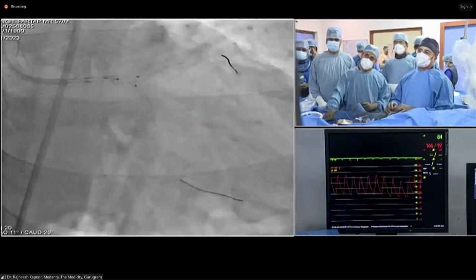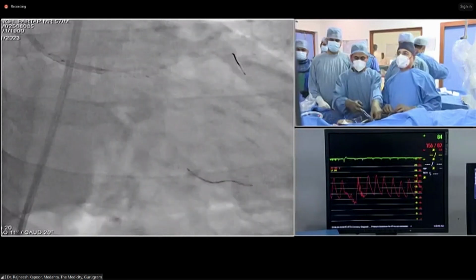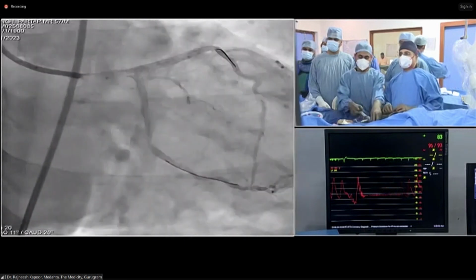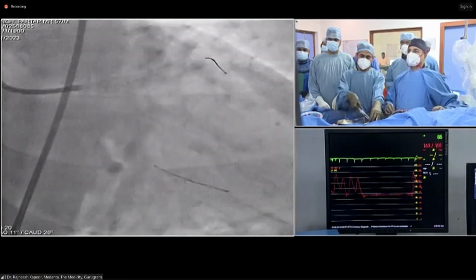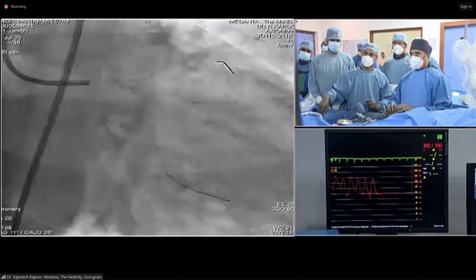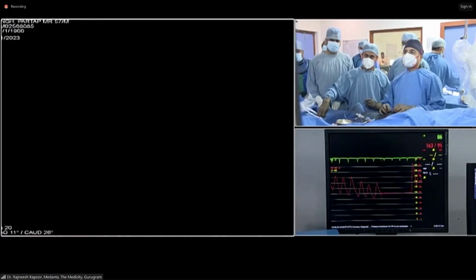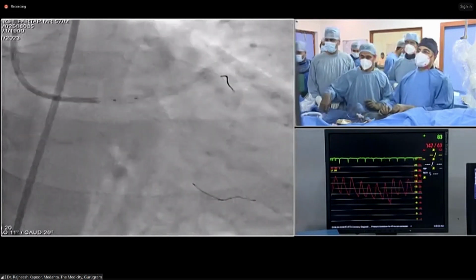So we'll give you an angiographic picture now. Hopefully it will be a nice one. Hold on. It looks nice now. The circumflex ostium is again nice. Okay, those are good. So this is how it looks. And I'm going to do the POT again and then if time allows, I'll show you the image. Okay, give me a stent boost for the POT.